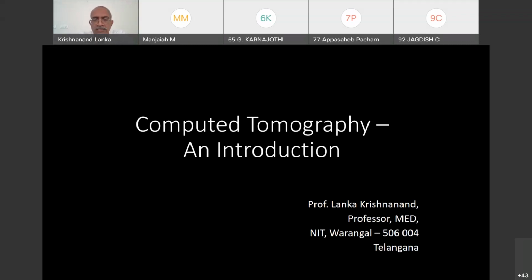So first of all, you have to reconstruct. You have to use a CT scan to get the 3D profile, the 3D form, of the hip bone.